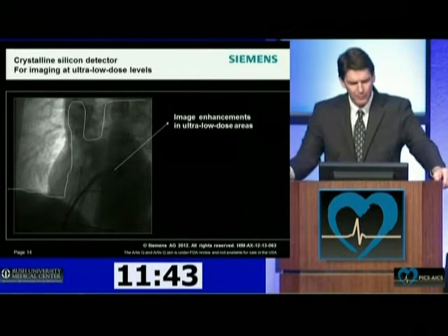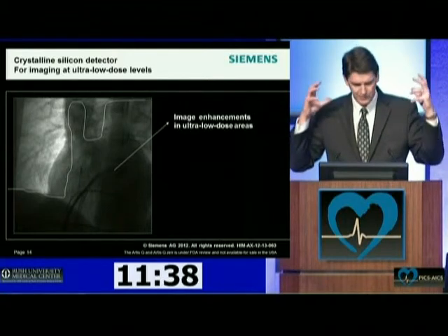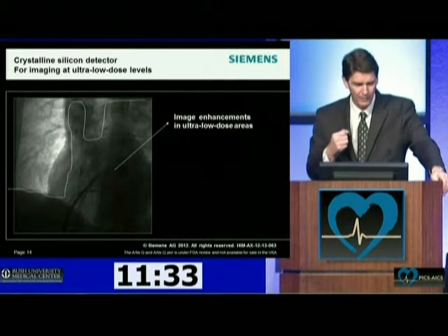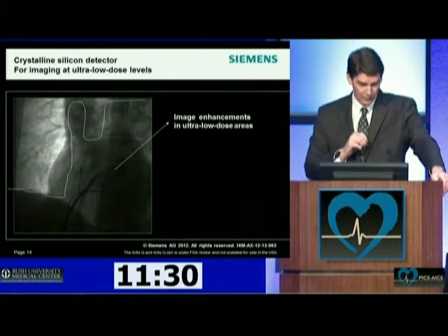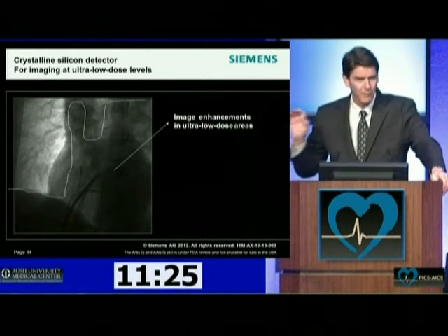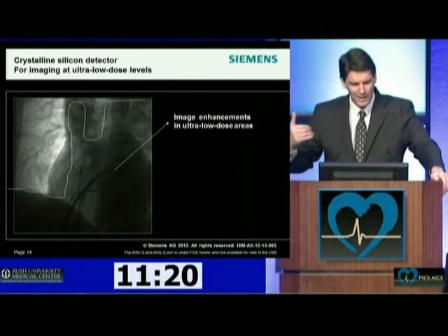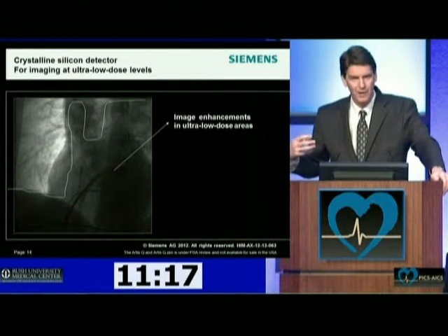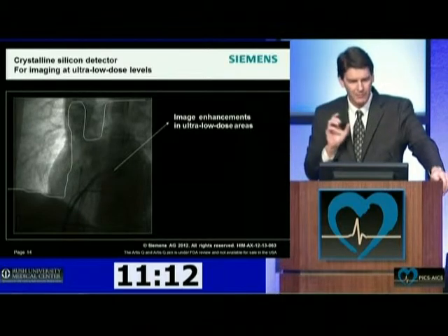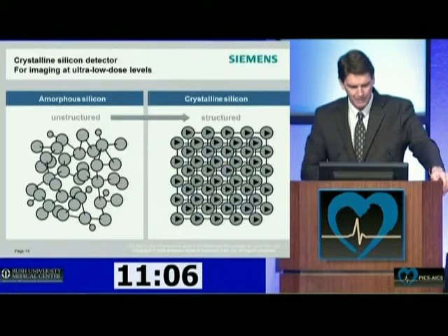And when you think of radiation dose and the ability to reduce dose, we always think of the dose per pulse and how much the patient receives and how much the operator receives. But I think where the significance of this very sensitive crystalline silicon structure comes in is when you look at an image, there are always dose-starved components of the same image. Some areas don't have much absorption and you have a very bright part of the image, but when you're trying to manipulate devices behind the spine or the diaphragm or at very steep angles, you always have very dark areas of the image, and I think that's where this technology helps to enhance the image presentation dramatically.